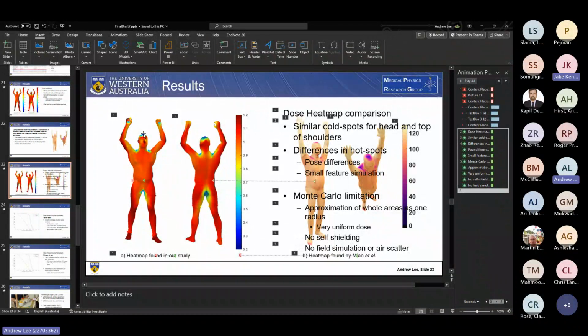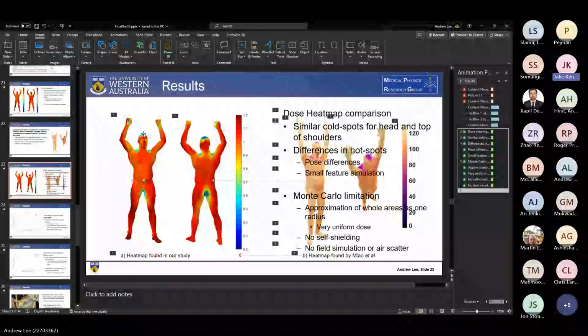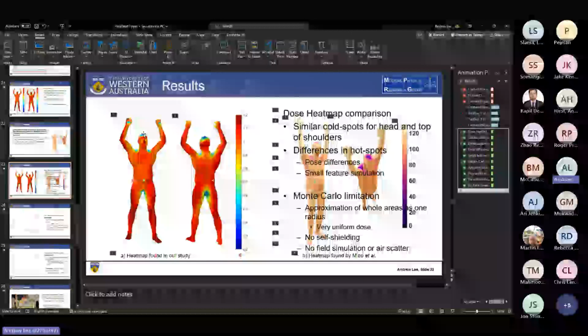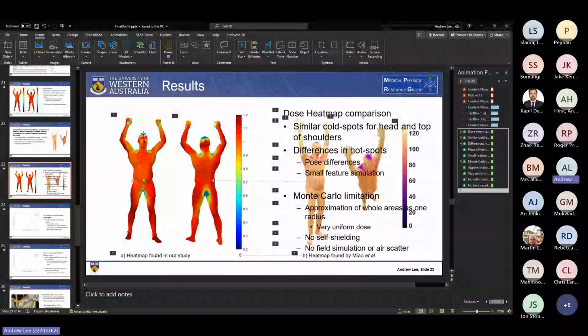Yeah, that's all good. I was just wondering if the shielding that you would likely implement would reduce that dose, or if it's just sort of accepted that you're going to have some side effects for the eye in this case. Yeah, sorry. So you'll potentially have some, but the limitation is 0.7 grays. And so standard lead shielding does provide that for the eye, although you do get additional backscatter towards the eyelids. And so that eyelid region does normally get higher dose.